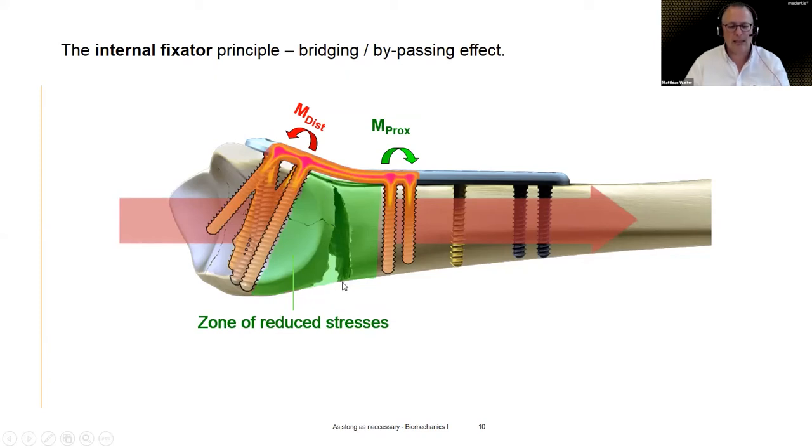There's not even the need to fill this void with any kind of bone graft or so. So that's simply not necessary. In the majority of cases, I have to say, I don't want to say there is always a situation where you have to stuff something inside, even with our material. So there's usually no end to complexity.